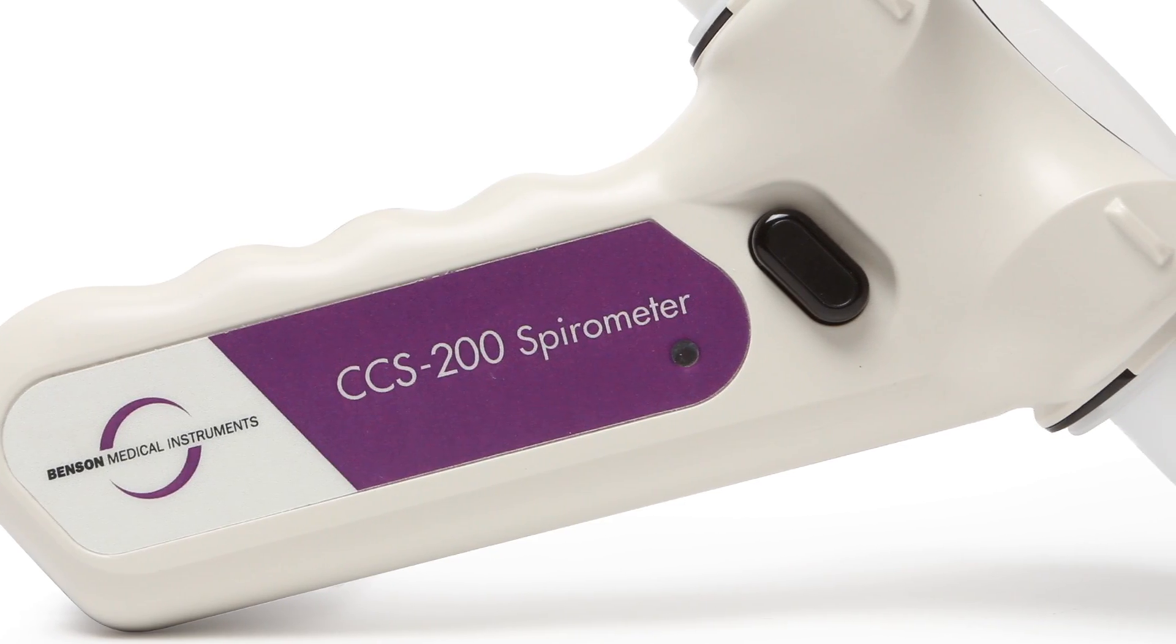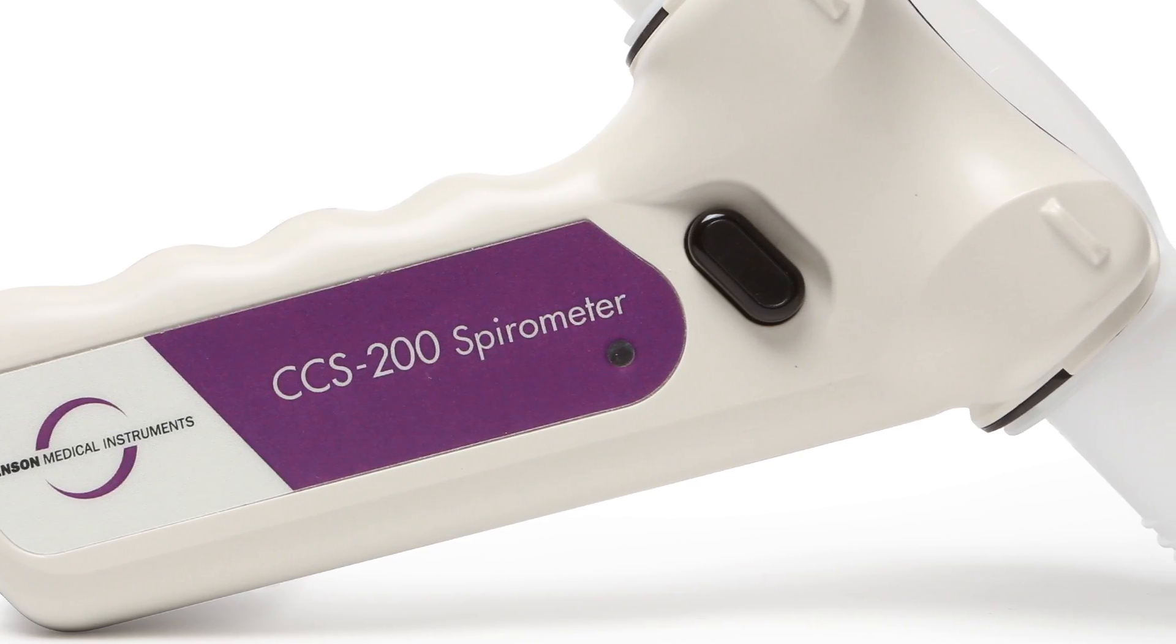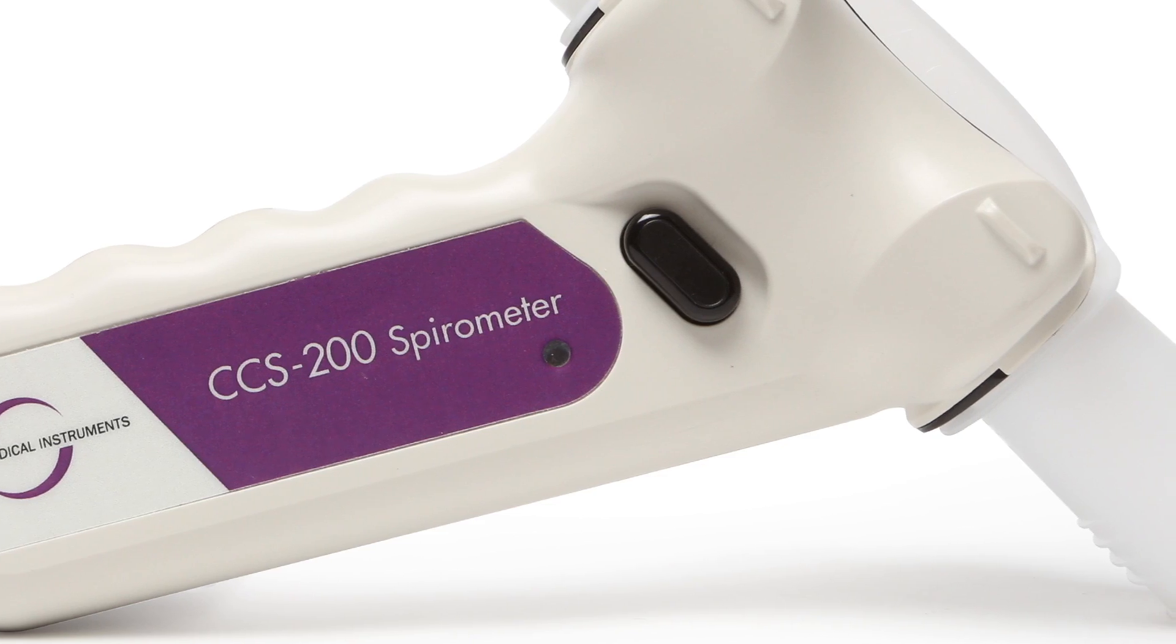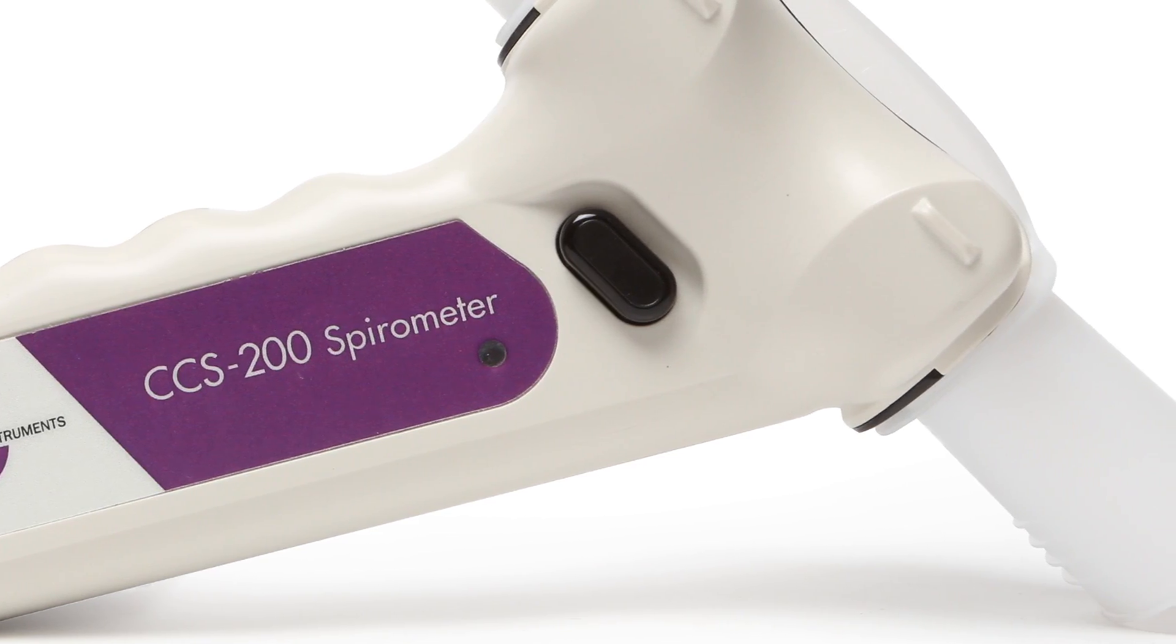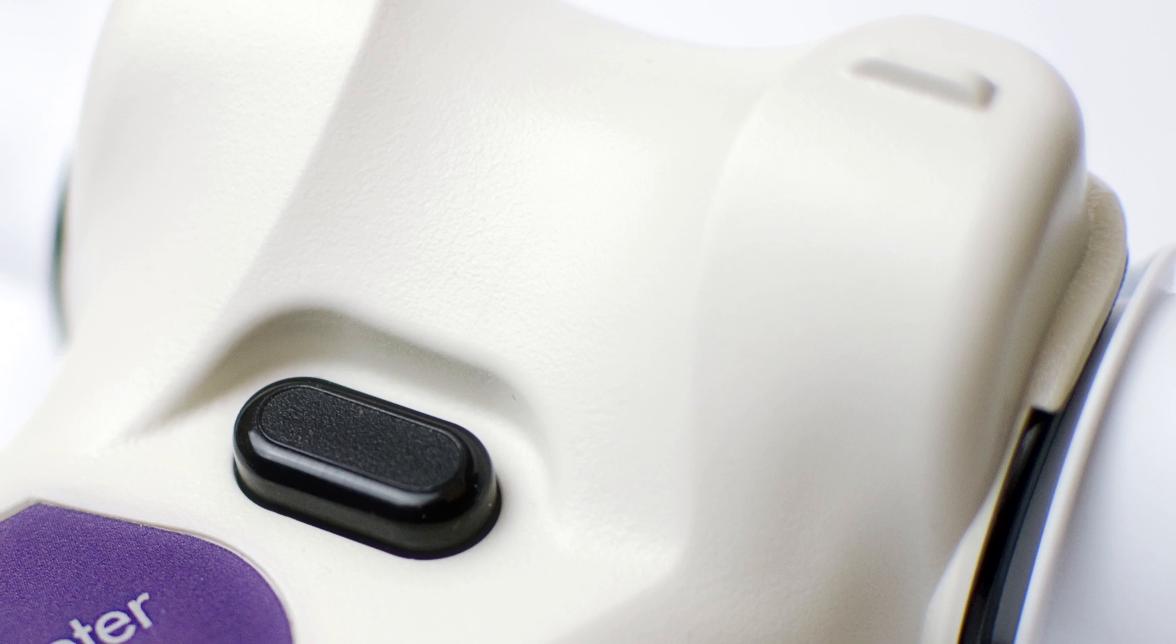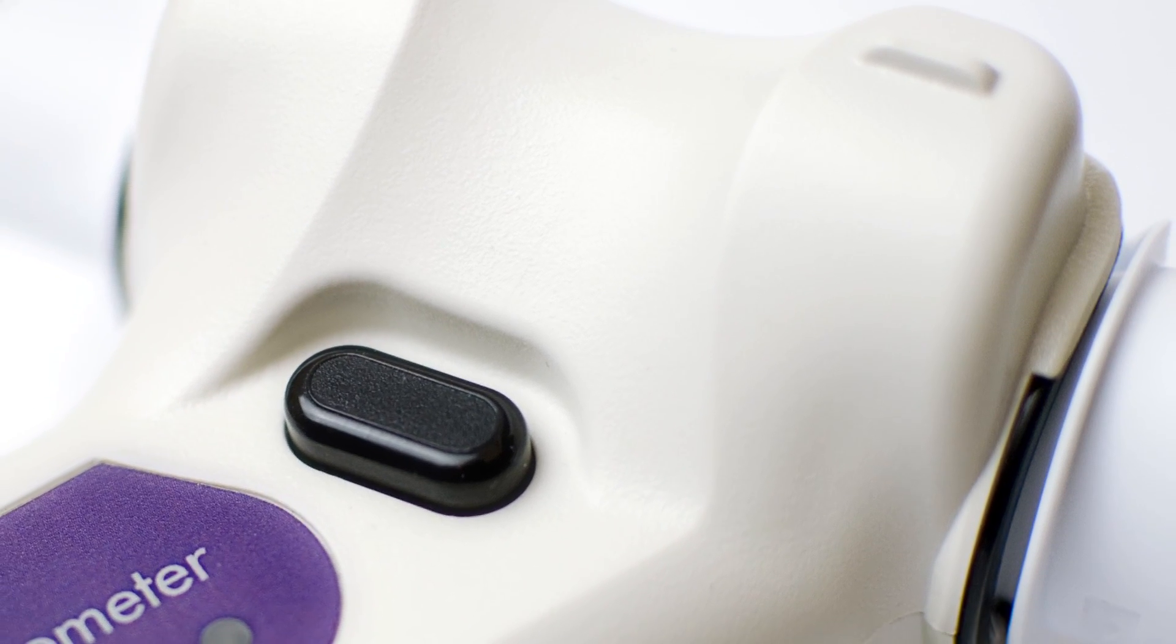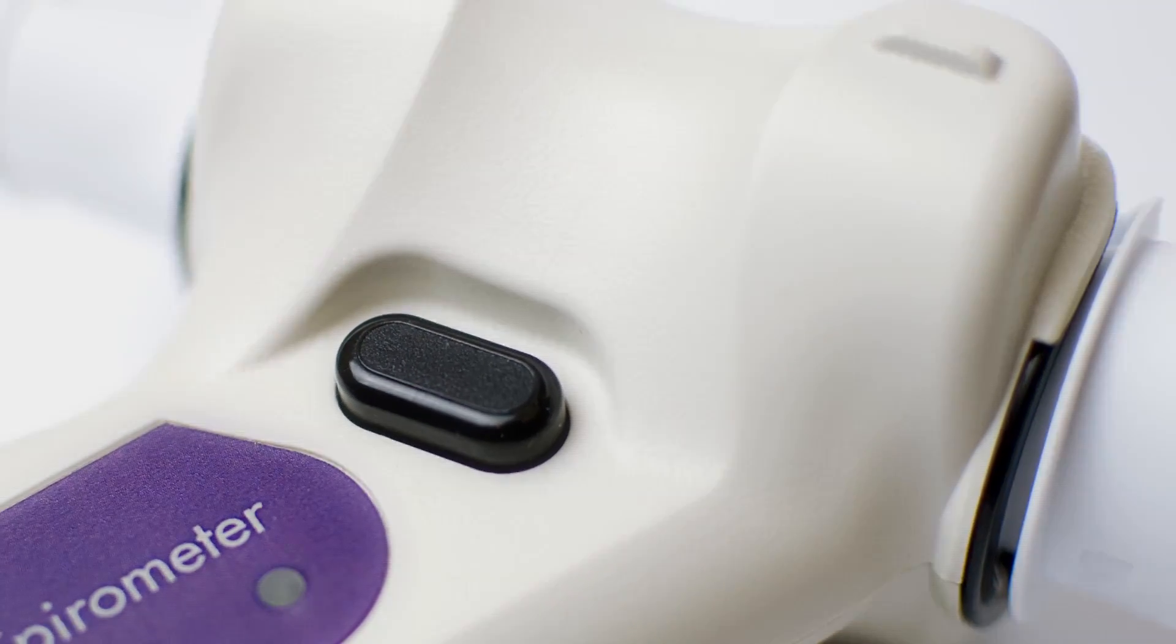The CCS200 Plus spirometer from Benson Medical Instruments is state-of-the-art in occupational spirometry. In this video, we'll talk about how to configure spirogram graphs on reports.